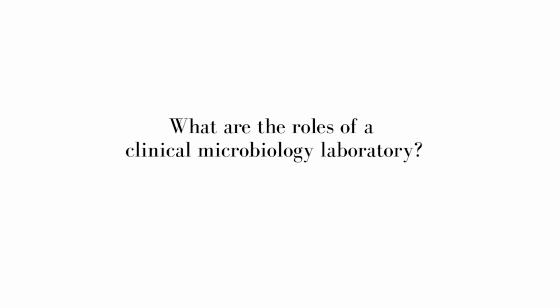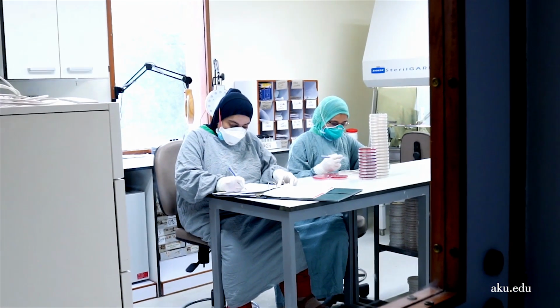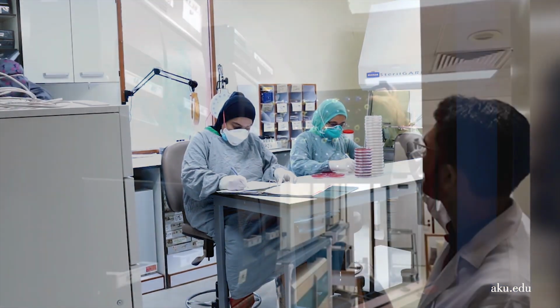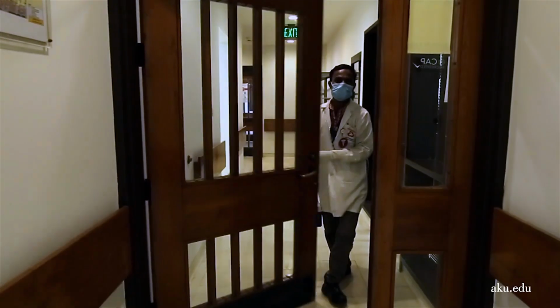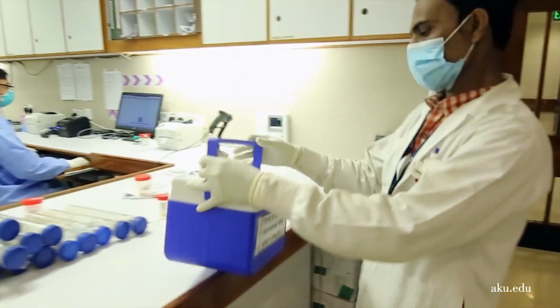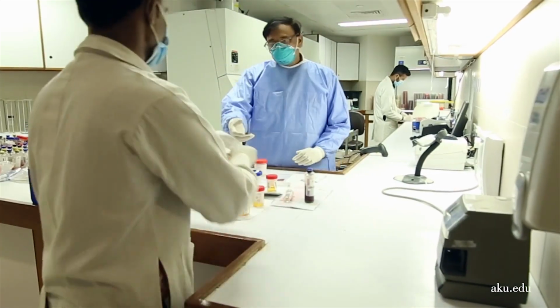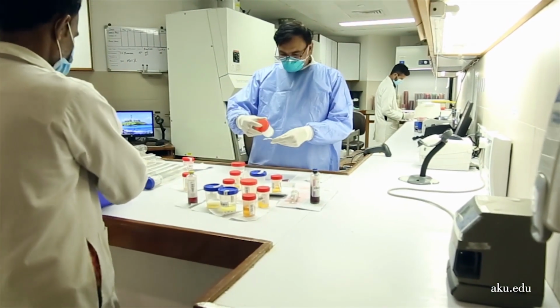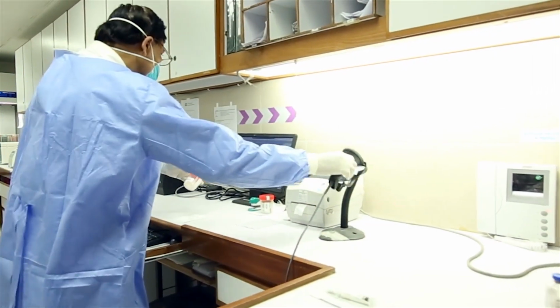What are the roles of a clinical microbiology laboratory? The major role of a clinical microbiology laboratory is to diagnose, prevent, and treat infections. A porter brings CSF and blood specimens with the requisition slip for CSF-DR, CSF microscopy, STAT, CSF culture, film array meningitis, and blood culture.